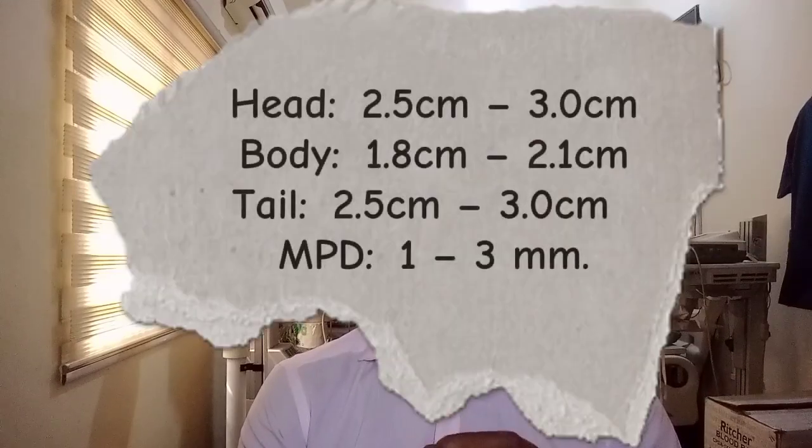Now, look at the dimensions of the pancreas. The size will vary with variable shapes of the pancreas and variation in age also. The accepted normal AP measurements in adult pancreas are: the head will be within a range of 2.5 cm to 3 cm.